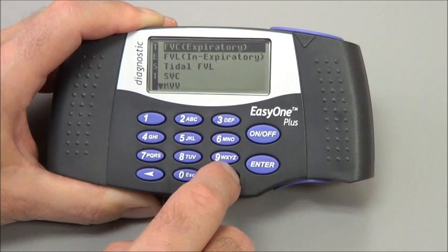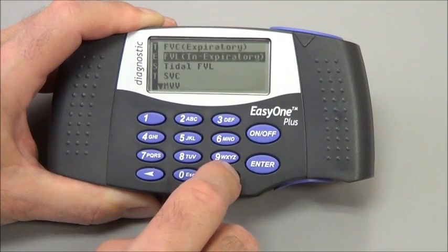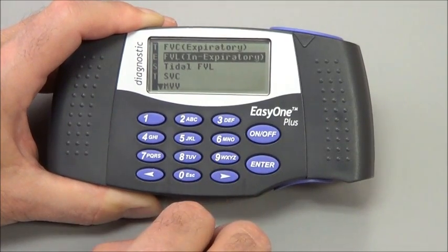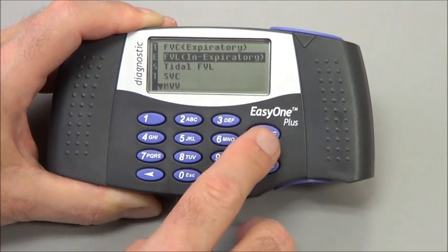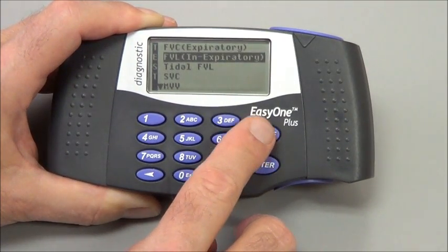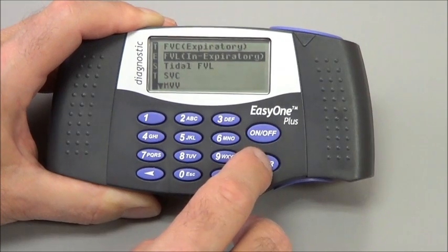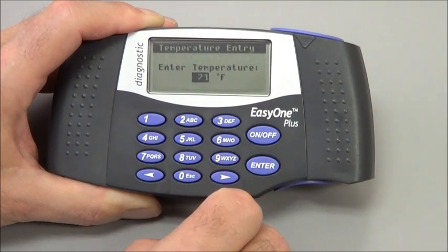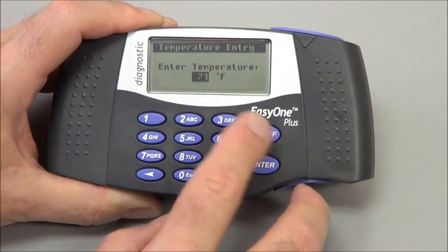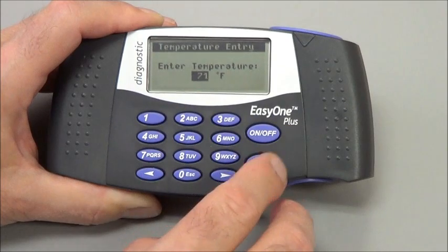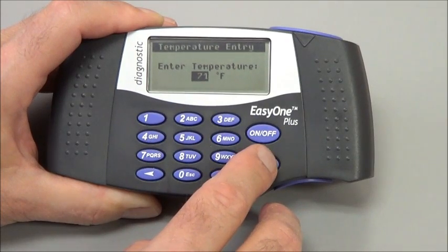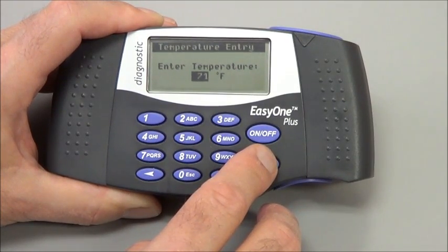In this demonstration, we're doing the flow volume loop test, which is the second test on the test menu. I press enter there and it asks me for a room temperature. It defaults to 71 — it's not critical — so I would press enter here to start the test.